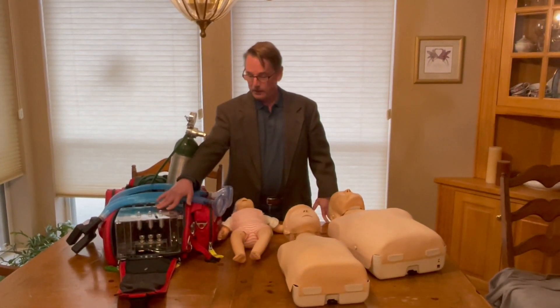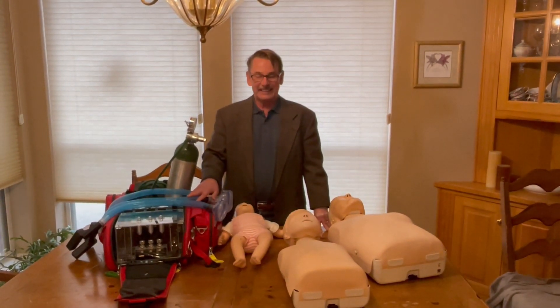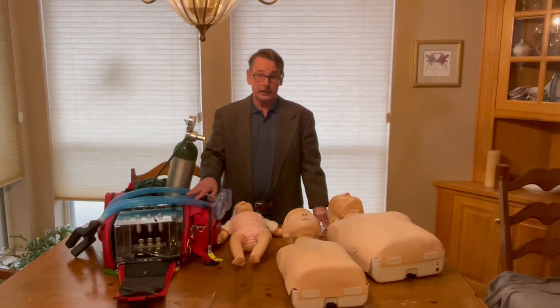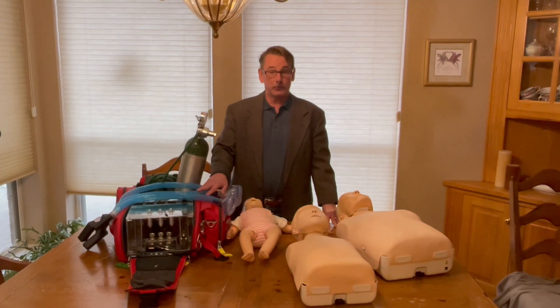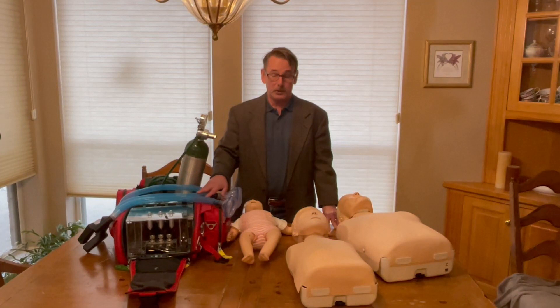That's this device here. This device is designed to replace mouth-to-mouth breathing or other less successful techniques for providing rescue breathing to someone who may need it. The American Heart Association, the experts at rescue breathing, have established protocols to be used for someone who's not breathing and needs CPR.